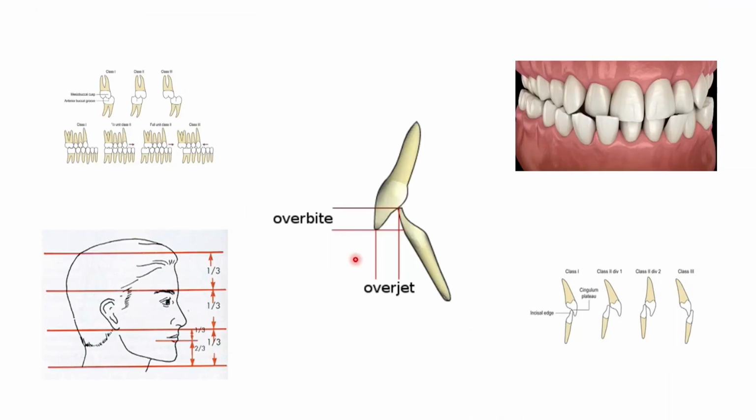Quick revision about some of those terminologies actually as well. We all know overjet and overbite. We know molar classes and incisor classes. What is sometimes missed is the cross bites, and so we can see here, I'm just going to give you just one tip.